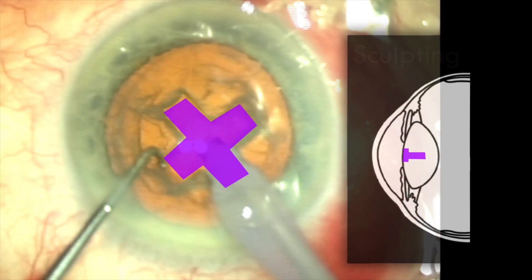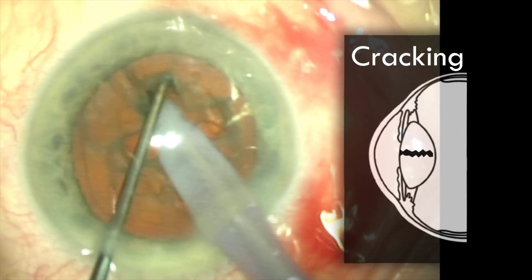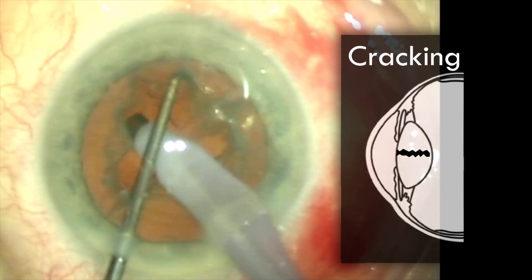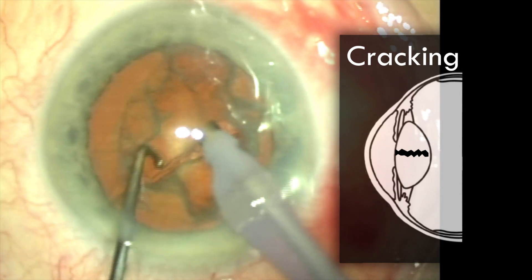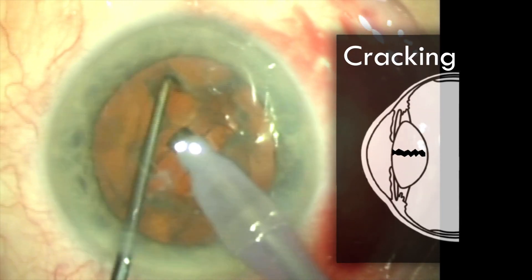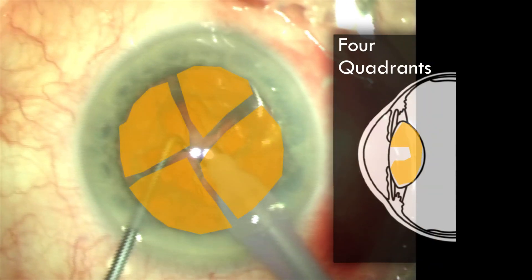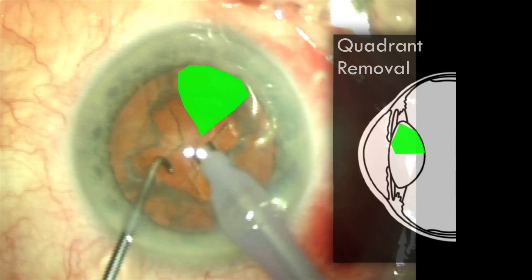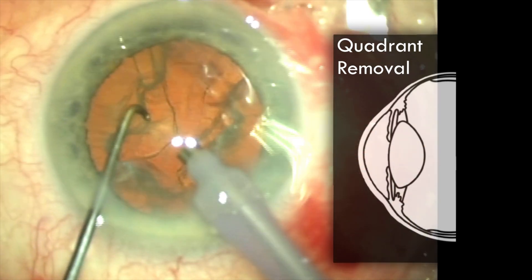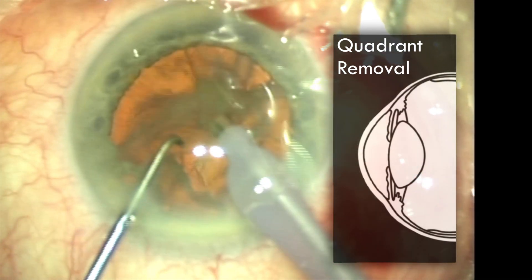Now that I've created a cross, I can move on to cracking. This is where I use both my instruments to separate and crack the cataract into four quadrants. Once the cataract has been broken down into smaller quadrants I'm able to emulsify them using the phaco probe. I've chosen to go for the smallest quadrant first, using the vacuum to bring the quadrant to my probe — bringing the piece into the safe zone of the anterior chamber and only then using the phaco energy to break it down. I also use my second instrument to manually chop the quadrant, to help reduce the amount of phaco energy used in the eye.